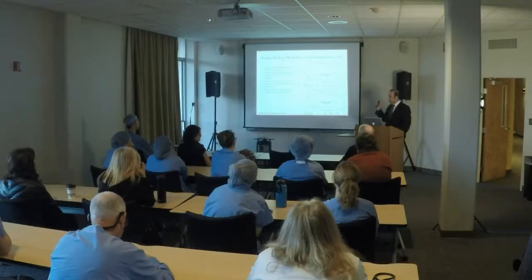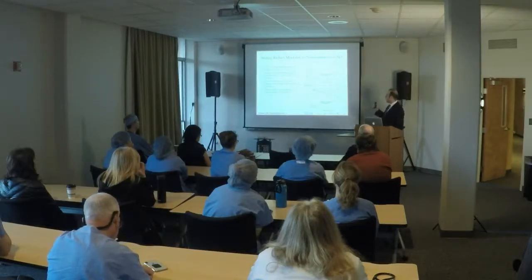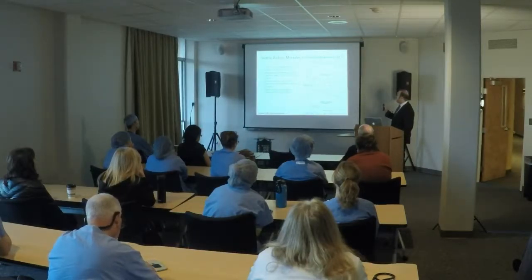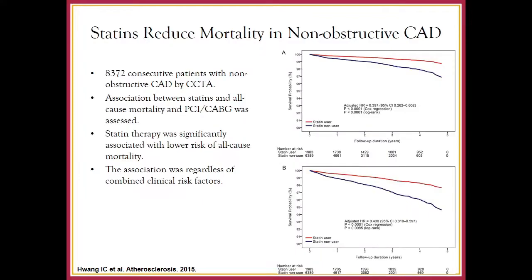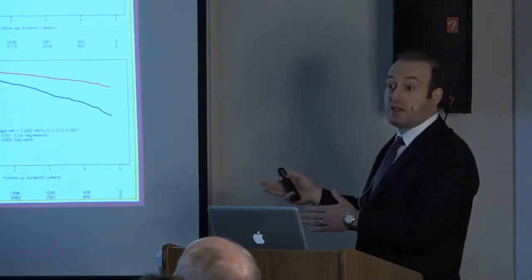Now, this goes back to the importance and the major value of CT in the identification of non-obstructive coronary artery disease. This study, published in 2015 in Atherosclerosis, studied over 8,000 patients who were all found to have non-obstructive disease, so less than 50% stenosis. And they compared those that were on statins versus those that were not on statins.